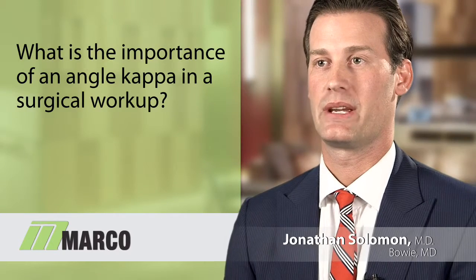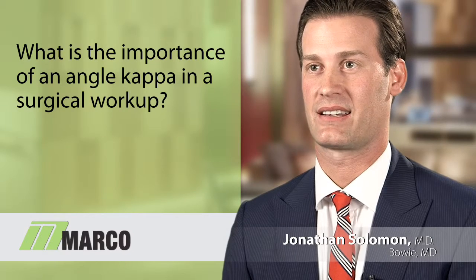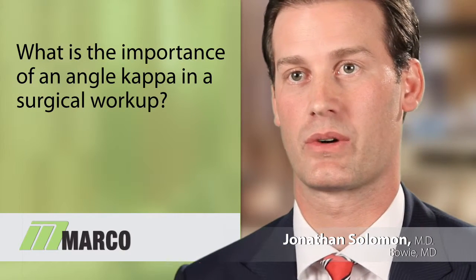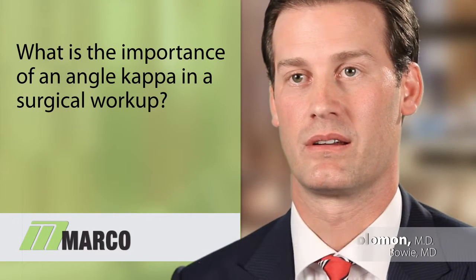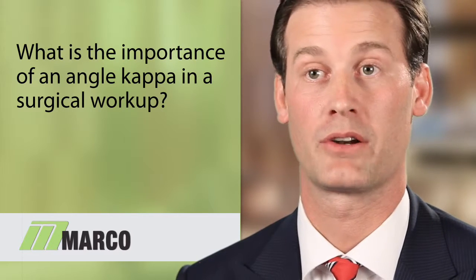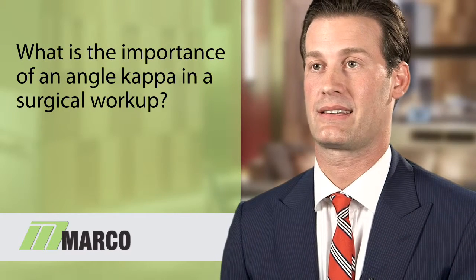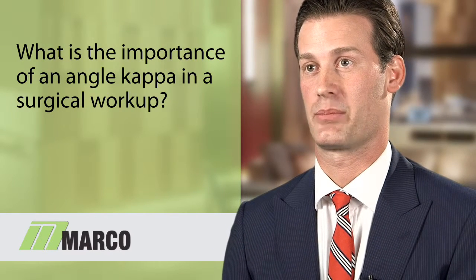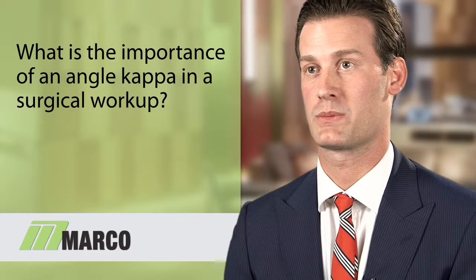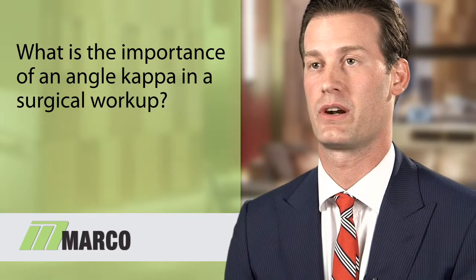The use of the OPD in better refining the exact type of implant, I think, is a critical aspect of achieving premium outcomes for patients. And that includes even monofocal lenses as well as multifocal lenses, certainly. But looking at an implant as it applies to a particular patient, or more specifically, to a specific pupil size, is also very important.